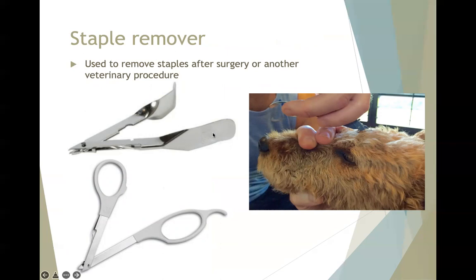These are going to be more like, think of your tweezers kind of a hold versus having those handles to actually loop your fingers and thumbs through. But the tips here are the same. I'm going to go under that staple and then that top portion here. When we clamp down on this tool, it's going to clamp on the staple and then cause it to kind of come up like a W, and we'll be able to remove it very easily.